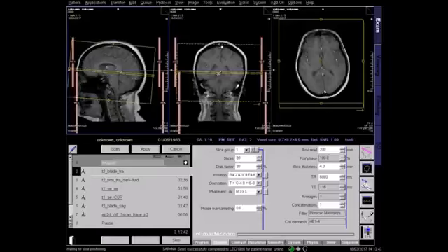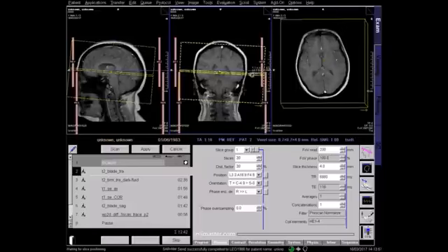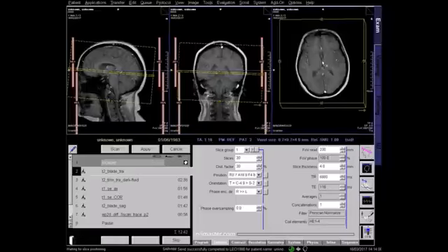On the coronal localizer, the central slice should pass along a line from the superior sagittal sinus through the 3rd ventricle and down the center of the brain stem. Center the axial localizer in the field of view and apply.